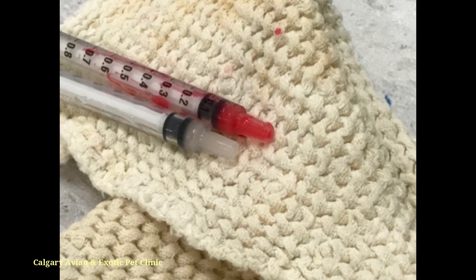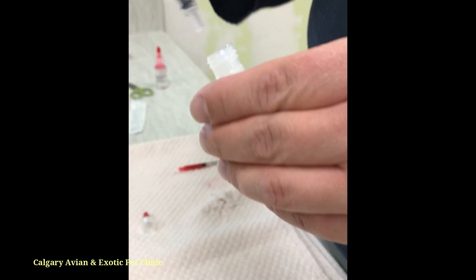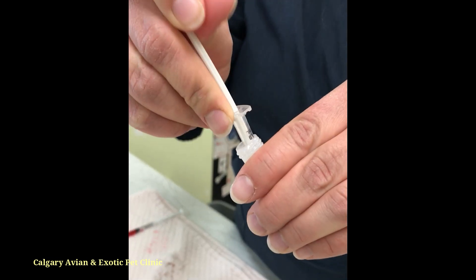To operate a syringe, first make sure the plunger is pressed down to the bottom of the barrel, then place the tip into the bottle of medication. Draw back on the plunger and the liquid will flow into the syringe. You may need to go back and forth on the plunger to dispel air bubbles.